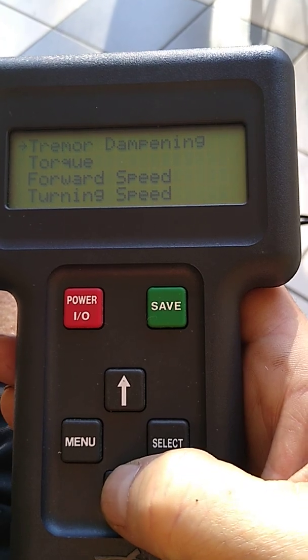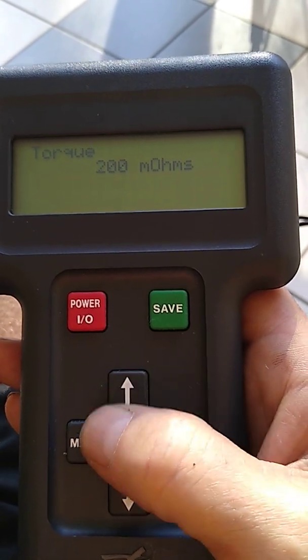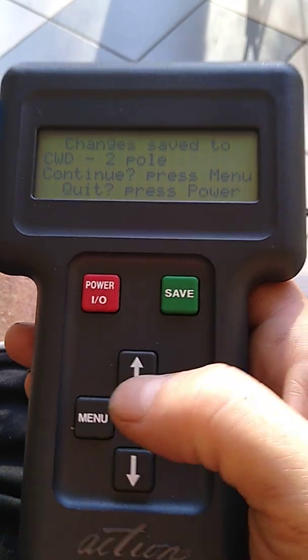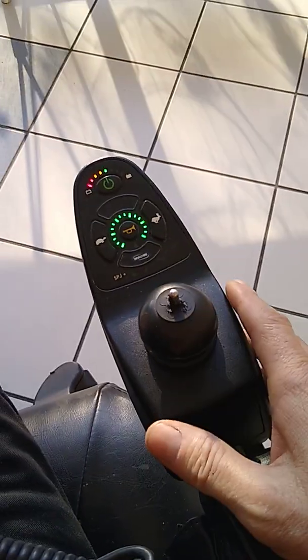Tremor dampening is actually important for smoothing out the ride. For torque, I'm setting it to the highest — I think it's 200 milliohms. Going ahead to save that and power off.